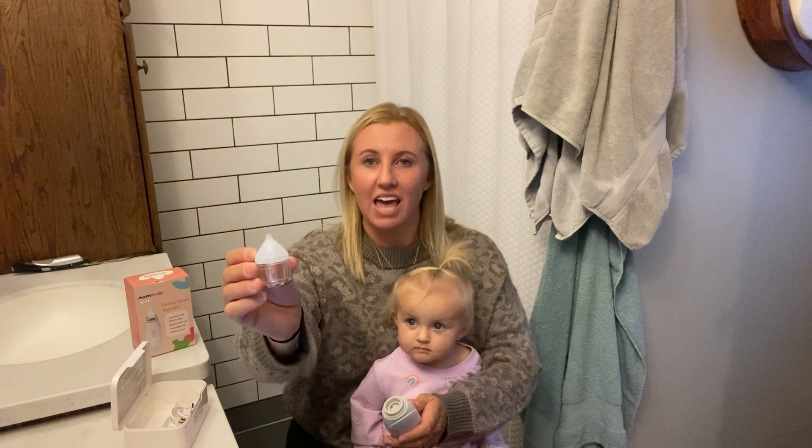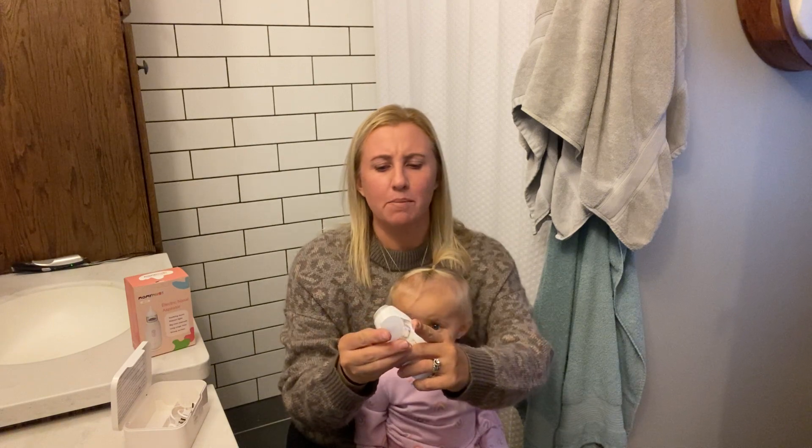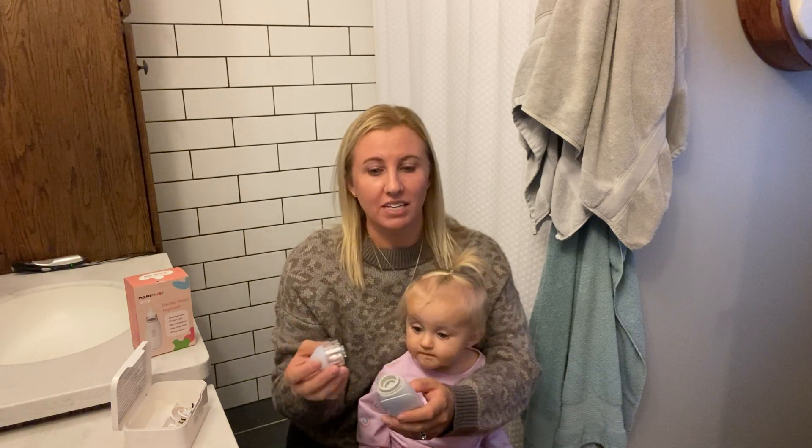This is the actual nasal sucker that you will stick up your child's nose to draw out all that mucus and snot. It also has a little chamber here that is really nice. It has a max line right here to show you that once you get a lot of snot in there, you need to clean this out.